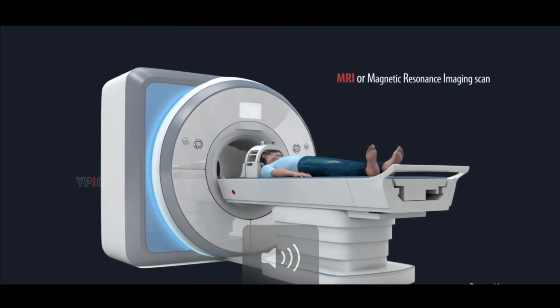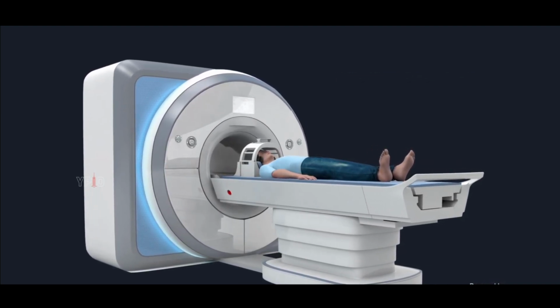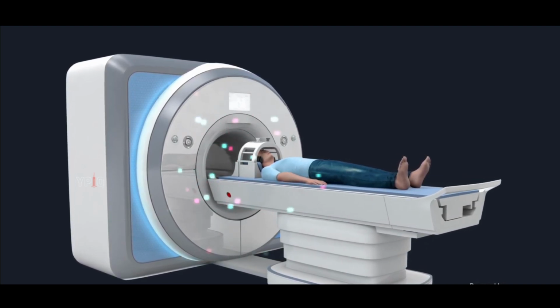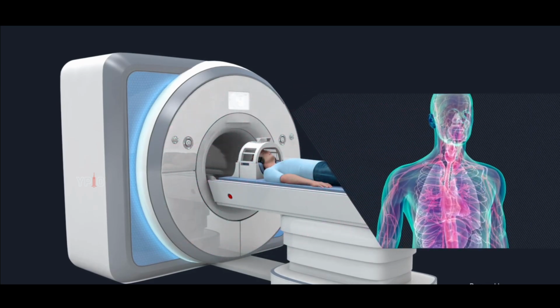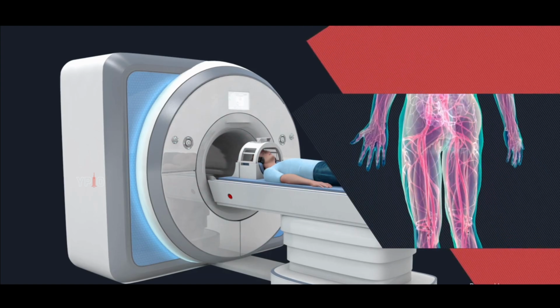Introduction. Magnetic resonance imaging, MRI, is a computer-based diagnostic imaging procedure that uses a large magnetic field and radio waves to produce detailed images of the internal structures in your body to detect any abnormalities. It is particularly useful for imaging the soft tissues which are not well visualized on X-rays.